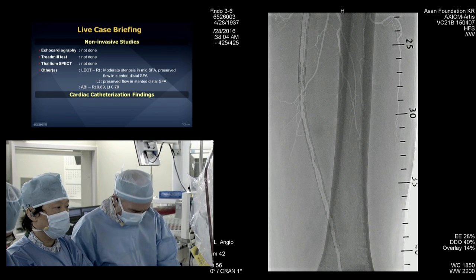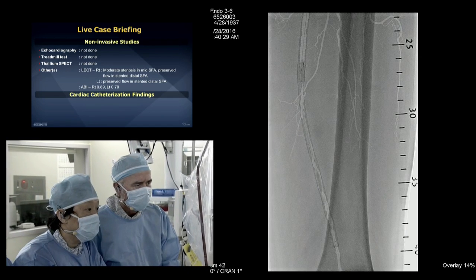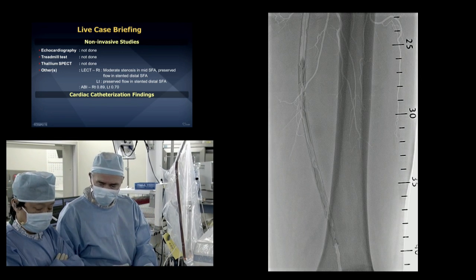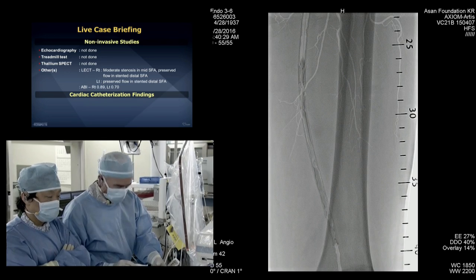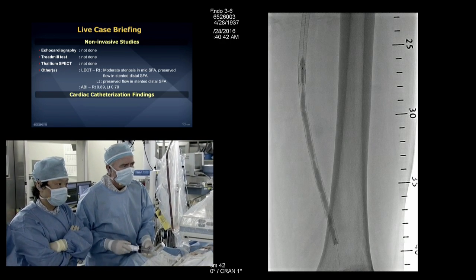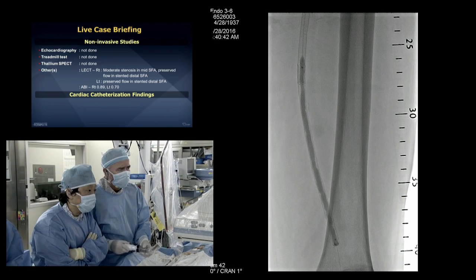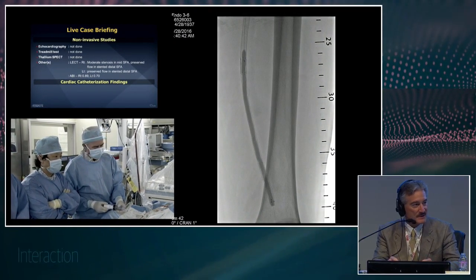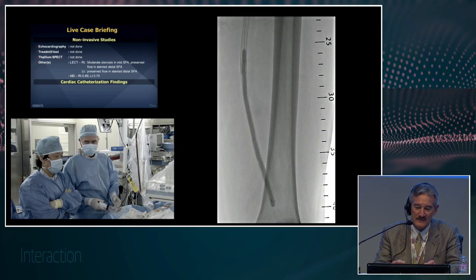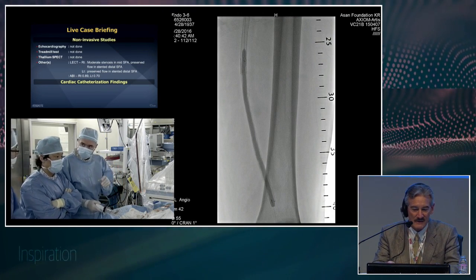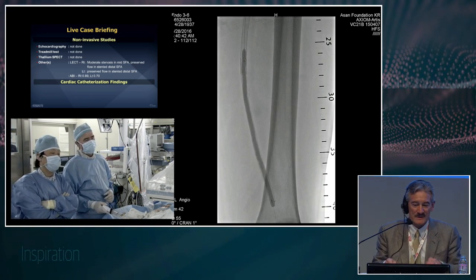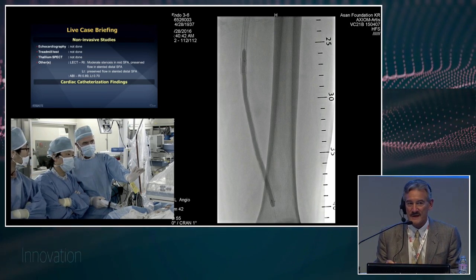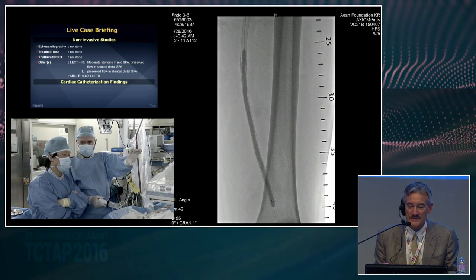We'll see what it looks like when it inflates. I'm going to go up diameter-wise — it's probably a pretty good diameter. There was one randomized trial — actually a single-center prospective study done in Germany — looking at laser debulking for ISR prior to application of DCB, which was positive in favor of the combination, showing laser definitely improved DCB outcomes. But it's only one study, so we have to be cautious.